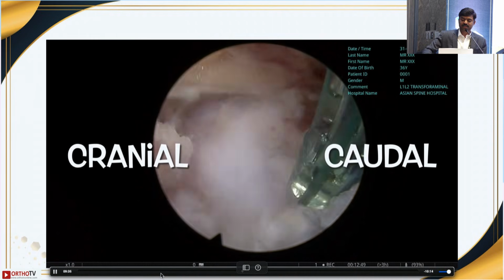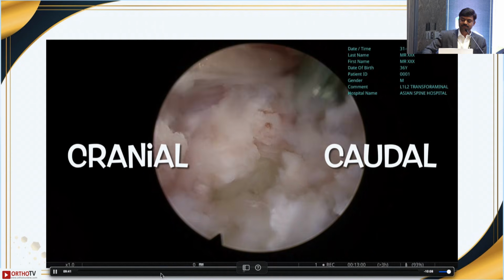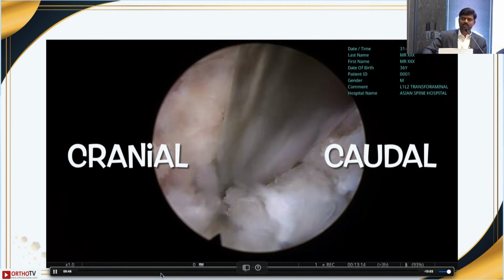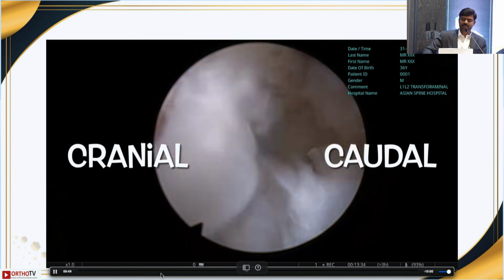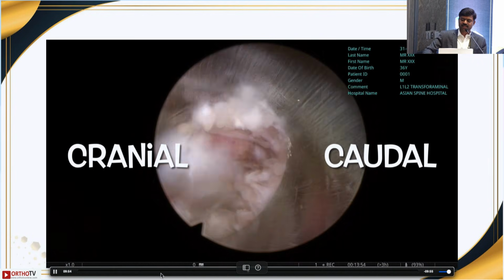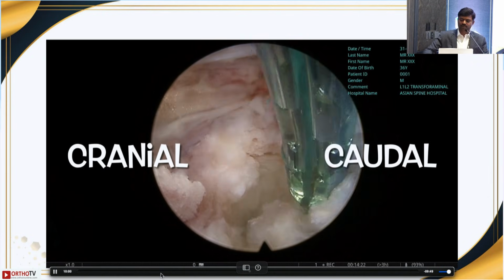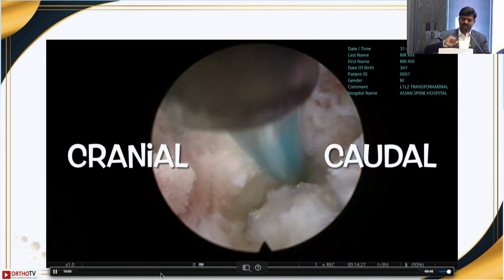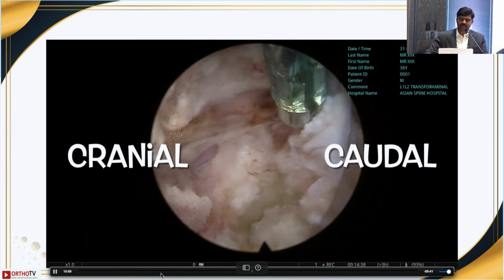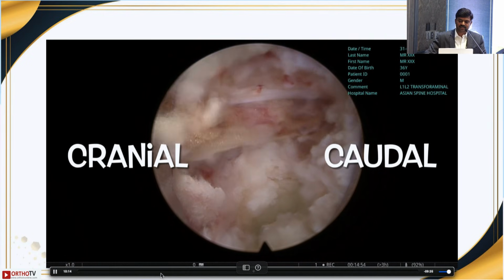So now what I am doing here is just defining the fragment further. The challenge here is again the instruments. You need to have good articulated instruments. You can use an articulated drill here, core out or eggshell the entire fragment and remove it. Or you can come out further, do a little bit of foraminotomy where you drill the facet so that you can depress your sheath further to go to this fragment. So you can see now the entire fragment with the calcified hump is seen there. That's what needs to be removed.